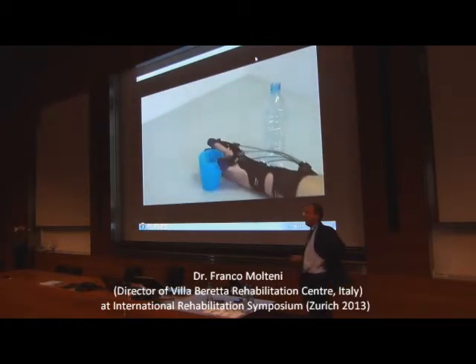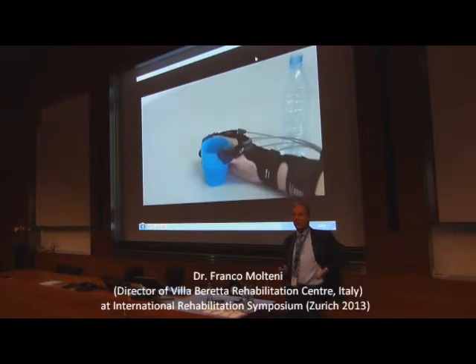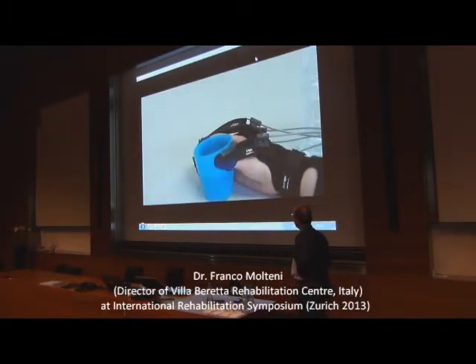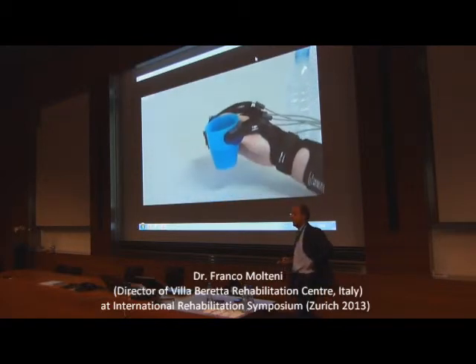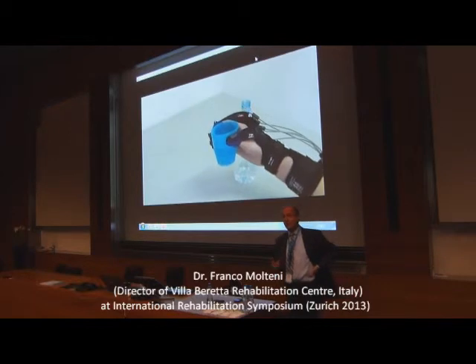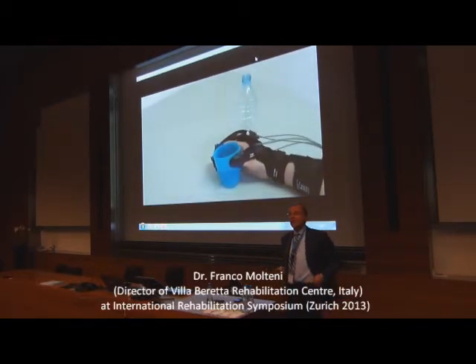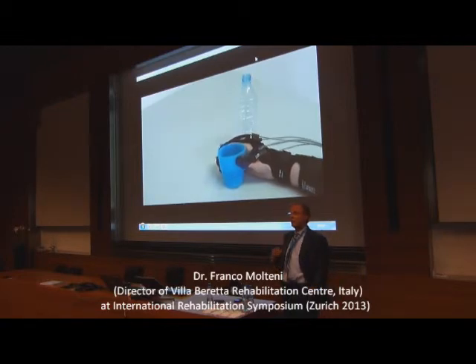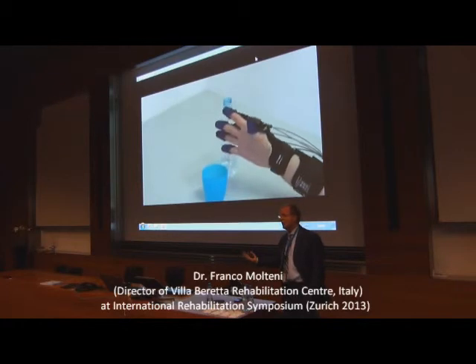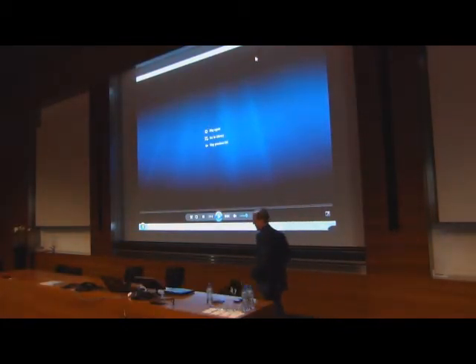Maybe you have to change the posture of the patient during the exercise, because we usually follow the patient in a sitting position, but we try to use exactly the same system in a standing position too, with or without any aids for the standing position, to check what happens in terms of trunk control and upper limb control, and to change the condition of the patient depending on the situation that you have to face.